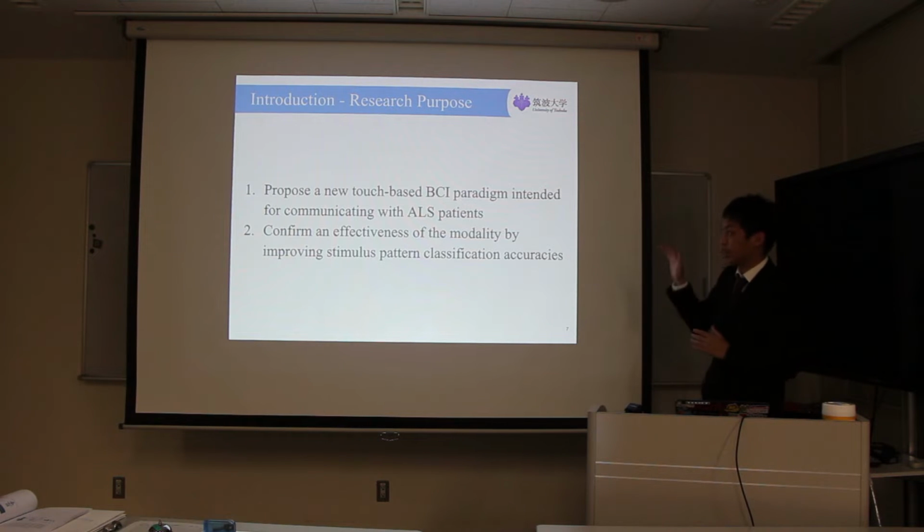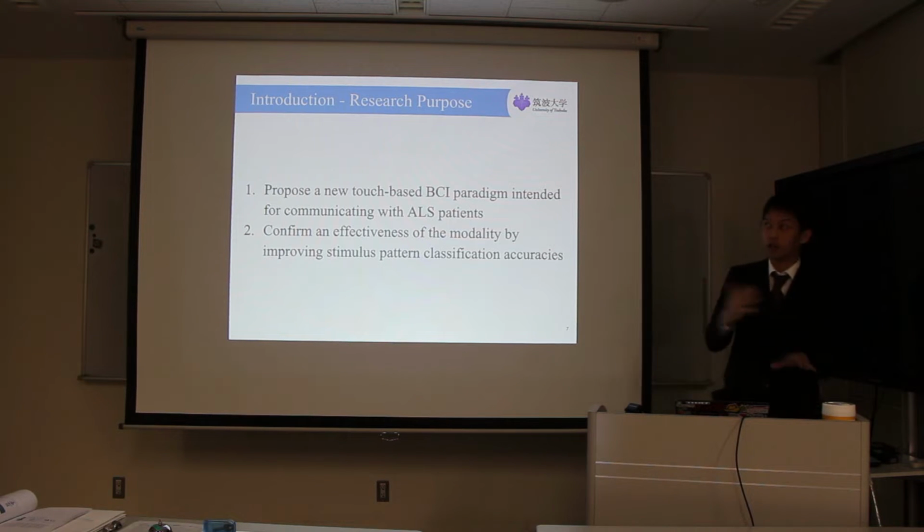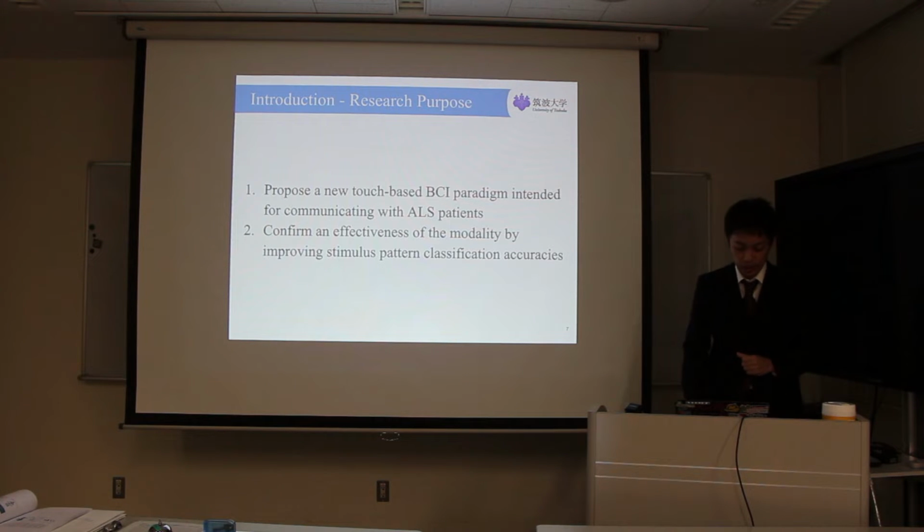By creating the new BCI paradigm, we will confirm the effectiveness of the modality, thereby improving the stimulus pattern classification accuracy, which is our most important criterion in the BCI study, that is, the command correct rate of the BCI users.